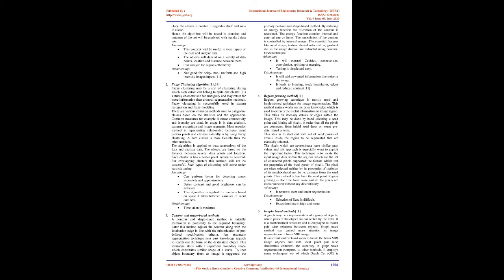1. K-means cluster algorithm. Among the existing algorithms, K-means cluster algorithm is one of the most extensively used. K-means algorithm is one of the simplest and most effective ways used in the solution of clustering problems, and it is a method that supports the concept that the gravity centers of the cluster elements represent the cluster. Since this algorithm is mainly based on an unsupervised technique, human intervention is not required in diagnosing the tumor.